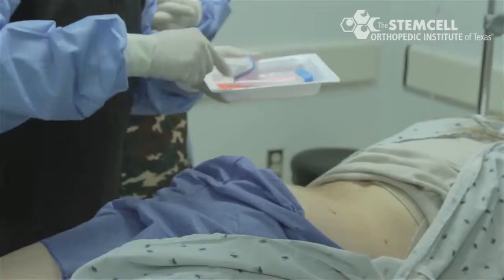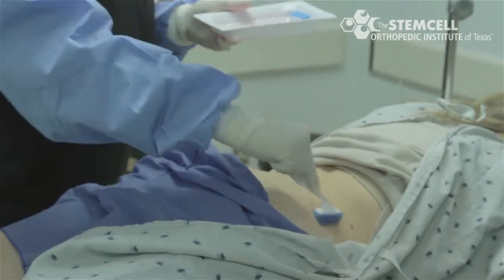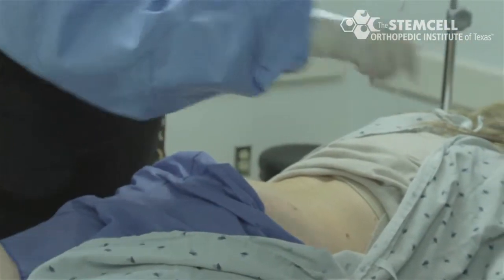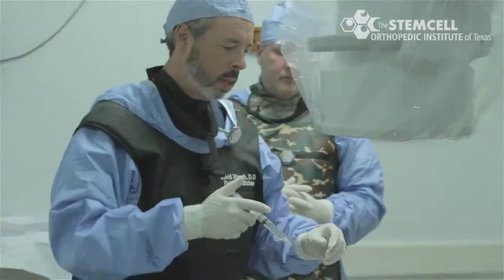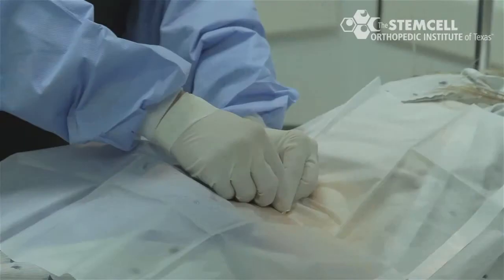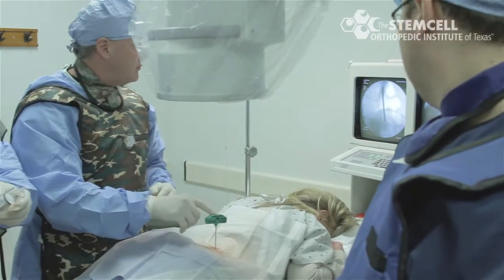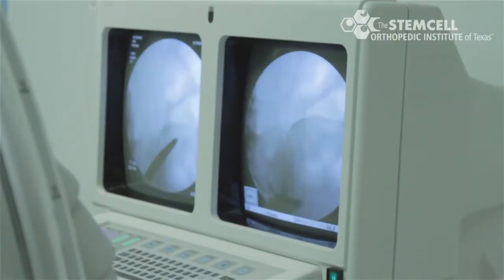The area over the skin is sterilely prepped and draped. A 1% lidocaine skin wheal is placed where the trocar will be introduced into the skin. After localizing with local anesthetic, a Jamshidi trocar is placed through the skin, watched under fluoroscopy to ensure the trocar is placed correctly into the iliac crest.